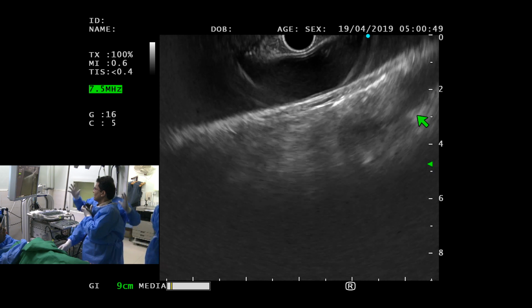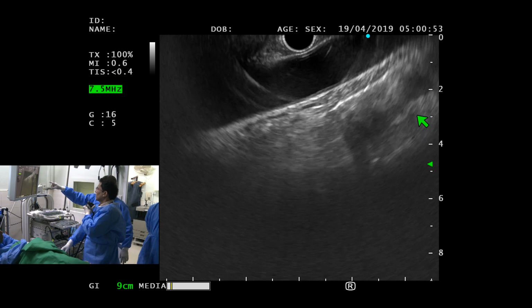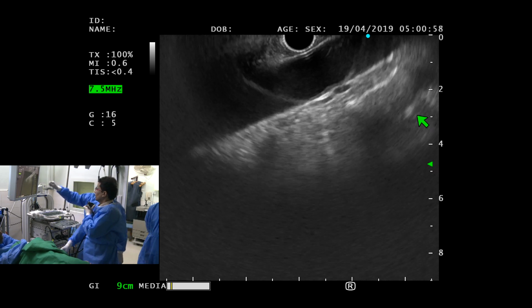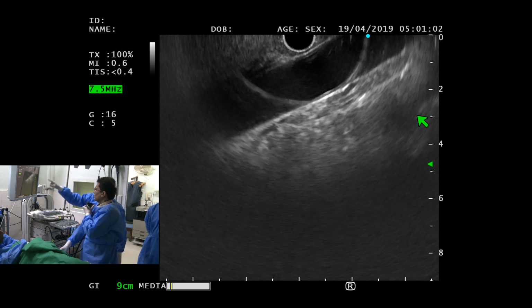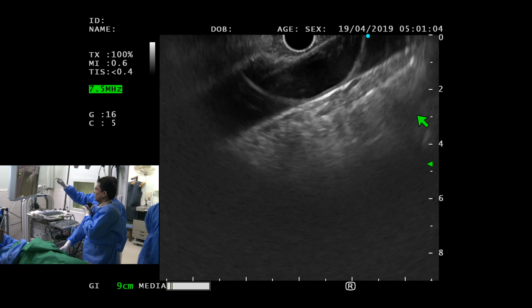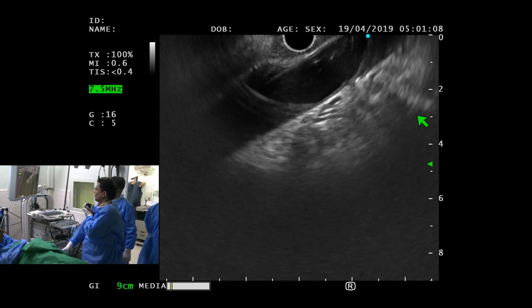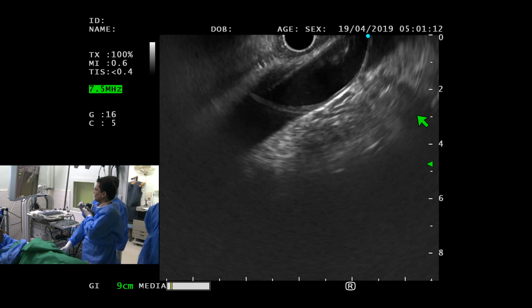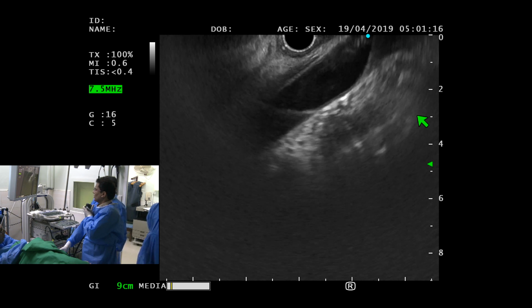So let your brain learn from your hand tips. That's the beautiful position as to where I'm going to get. So push through very slowly, millimeter by millimeter, keeping. अब ये बच्चे की starting position, remember? Yeah. So right. So push very gently, millimeter by millimeter, keeping aorta at the focus. Yeah. Keep going. I'm very happy for you to go.